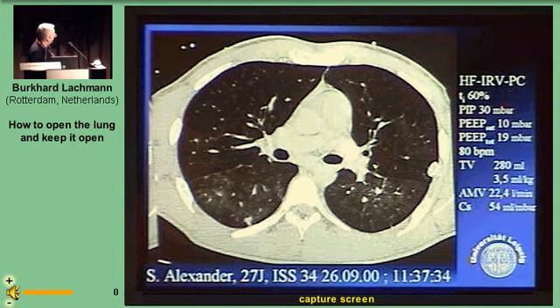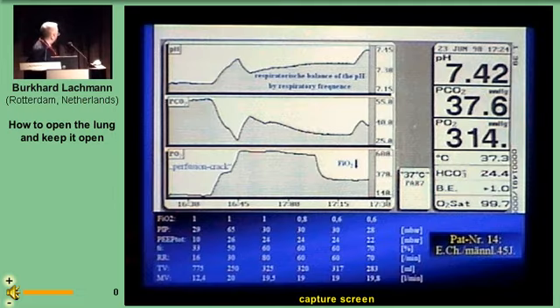And at a pressure now 5 centimeters lower than I showed you initially, you have a totally open lung half a minute later. And here's an online recording from arterial blood gases. As you can see here, before recruitment, the patient was ventilated with 100% oxygen, with peak pressure 29, PEEP total 10. Then a recruitment maneuver with 65. PO2 increased almost to 600 millimeter of mercury.